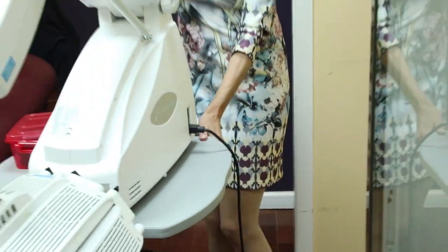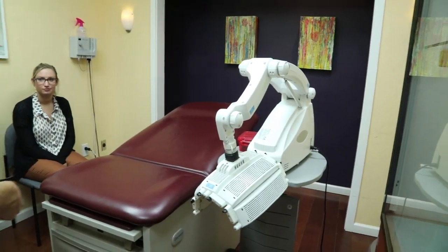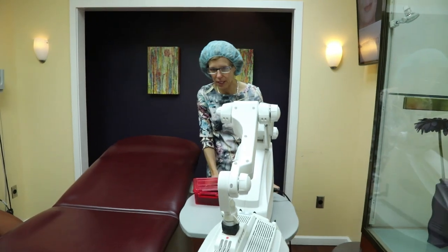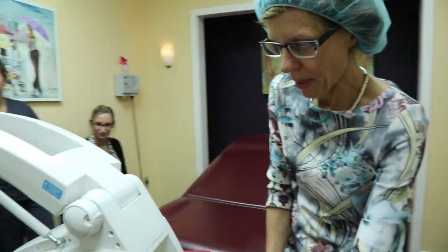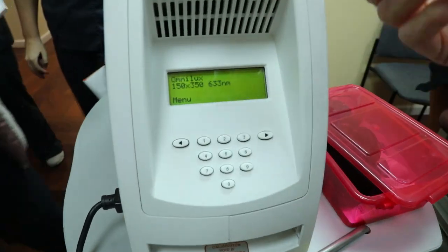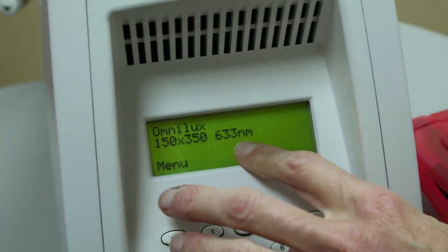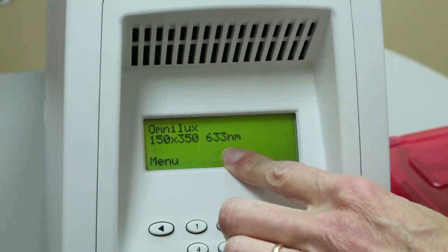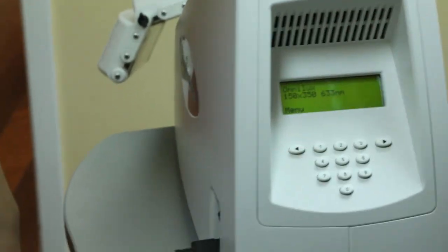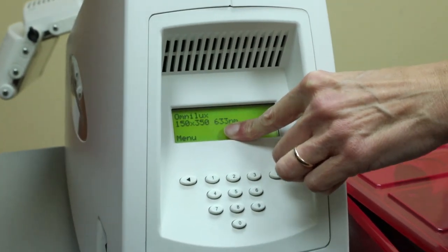There's a code that we need to use to activate the machine. The code is 1-2-3-4. It will give us the menu. This is on automatically if you have the red light filter on — it will tell us 633 nanometer. That is red light. We have red light and blue light.